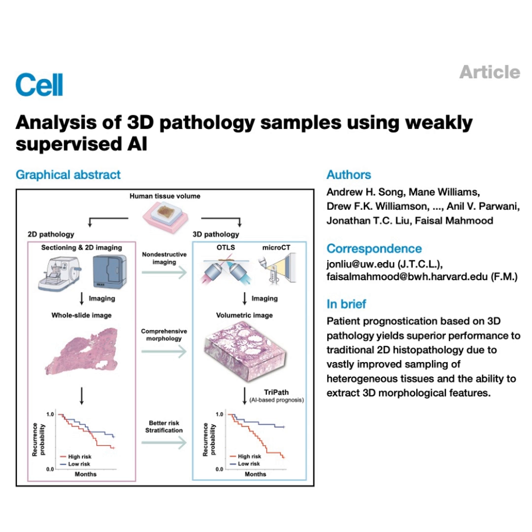Today we're looking at something that feels, well, almost fundamentally broken in how we diagnose disease. I mean, think about it. For more than 100 years, the gold standard, histopathology, it's all based on a bit of a simplification, isn't it? It really is. Human tissue, your body, it's all 3D, obviously. Right, a tumor isn't flat. It has depth, complexity, different bits doing different things. And exactly, heterogeneity. But the diagnosis, often the critical one, comes from looking at what? A single, super thin 2D slice on a glass slide.